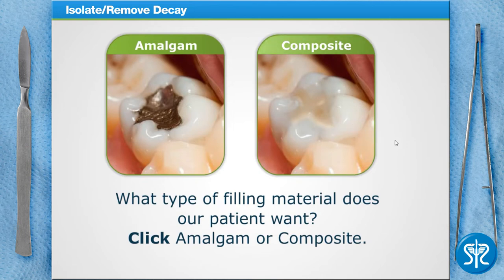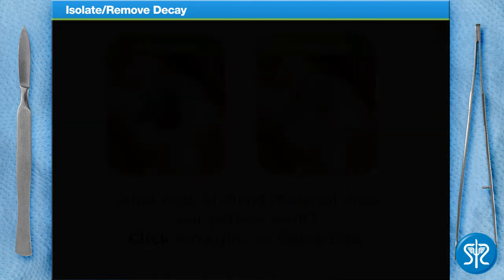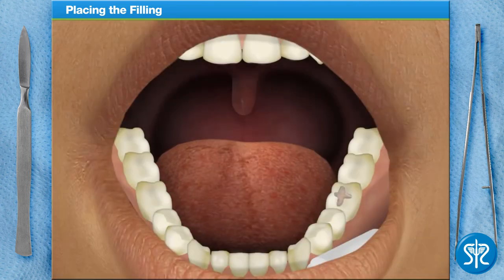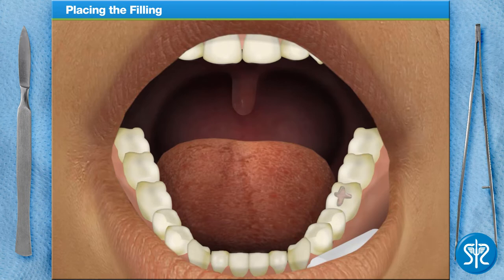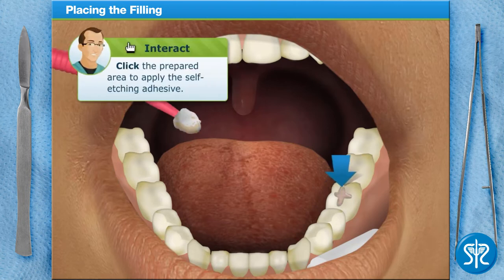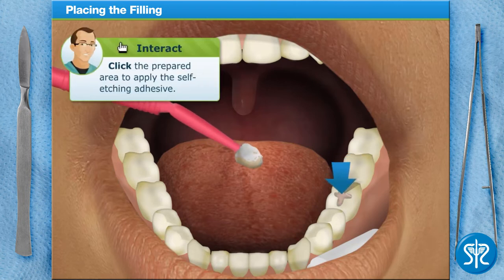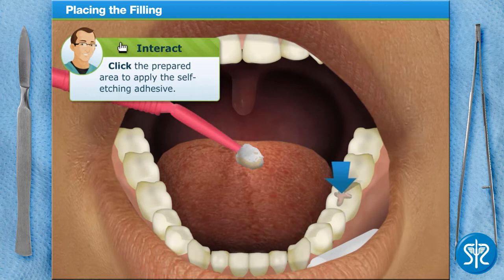Sounds good to me. For a composite filling, we need to apply a self-etching dental adhesive to the prepared area of the tooth. This creates a rough surface that helps the filling bond to the tooth.